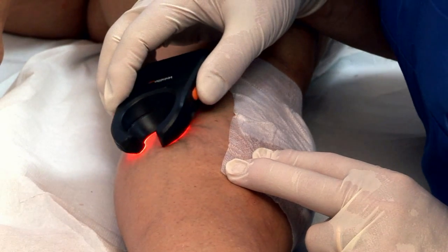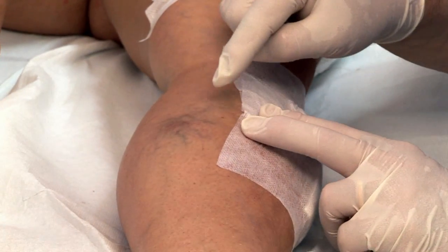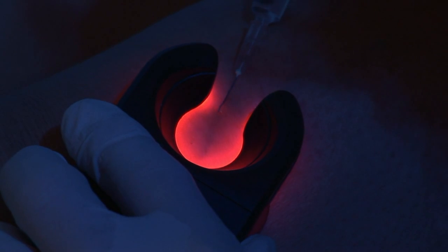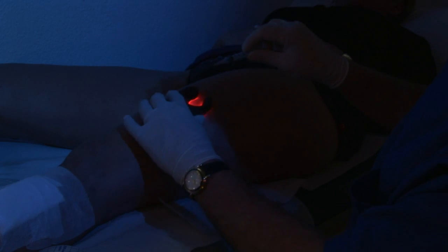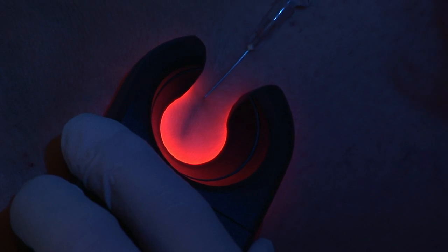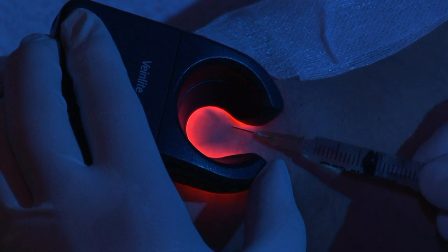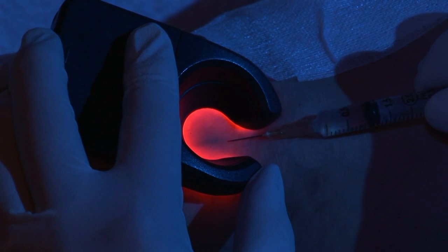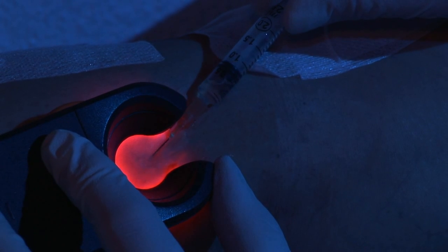With the aid of a vein detector, such as the mobile battery-operated vein light LED, superficial veins are easier to find. The red or orange lights of the LED ring lights allow very clear visualization of telangiectasias and reticular veins, resulting in targeted, faster, and more effective sclerosing. The vein light is particularly useful in showing the feeding veins of telangiectasias, which, without the vein light, are often invisible and hence remain untreated. Untreated feeding veins can result in unsuccessful therapy.